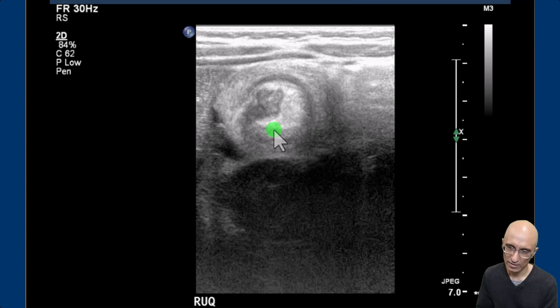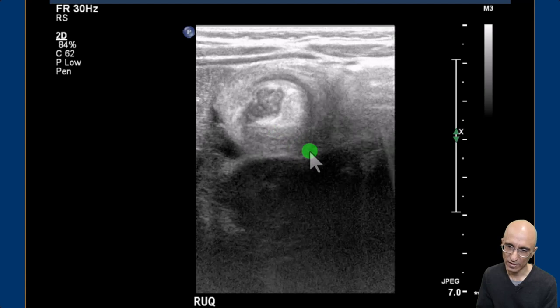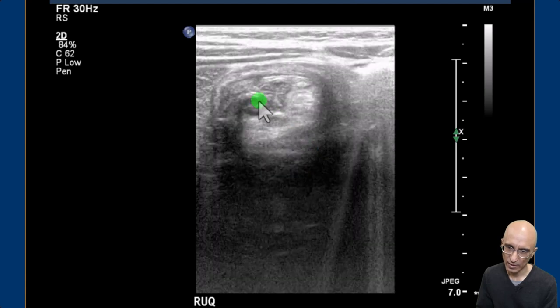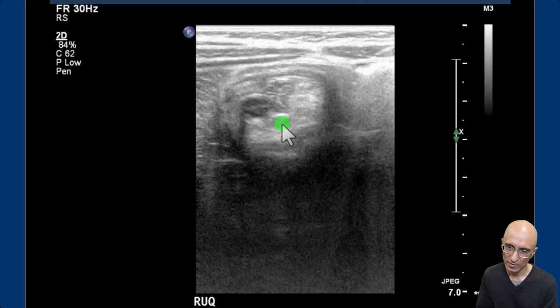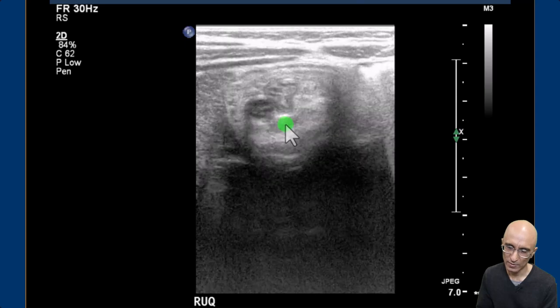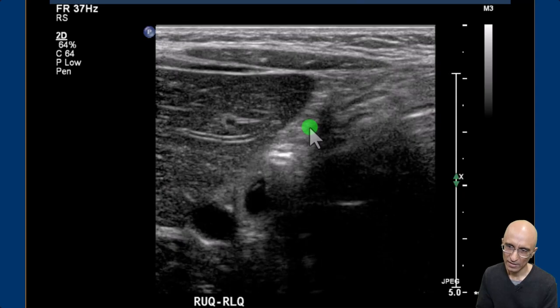You can see the terminal ileum and the internal echogenic mesenteric fat. You can also identify the appendix, the terminal ileum, and you can also see some lymph nodes within the mesenteric fat.